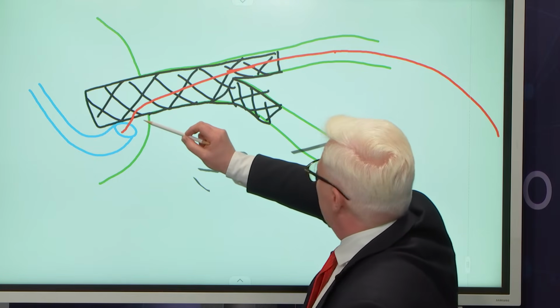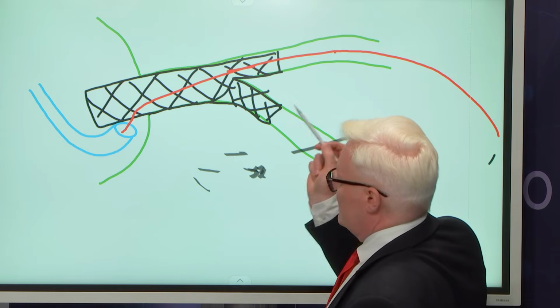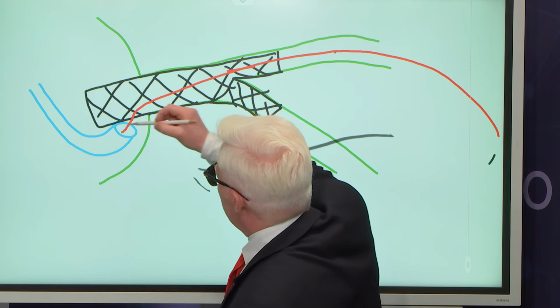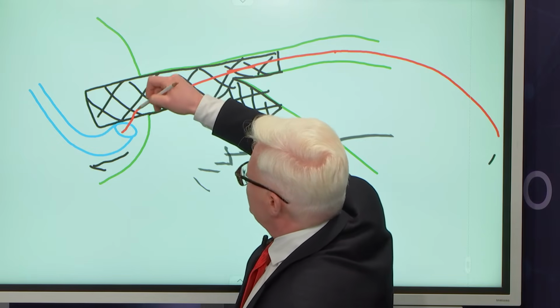And of course, you can try a few times to find the appropriate way, but the better way to go is just to push this wire distally, non-hydrophilic. Usually, for this purpose, you use just a BMW wire. And then when you push this wire, your guiding catheter will go back. Disengage. Yes, disengage.